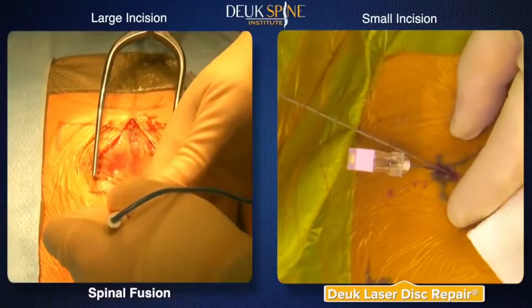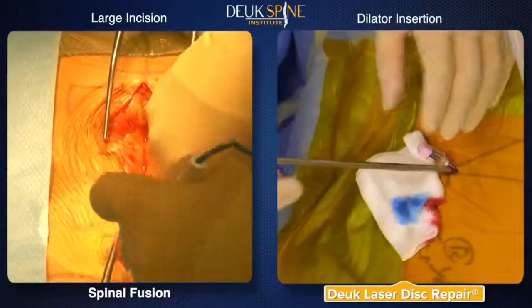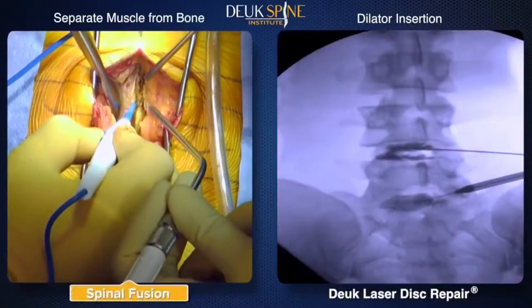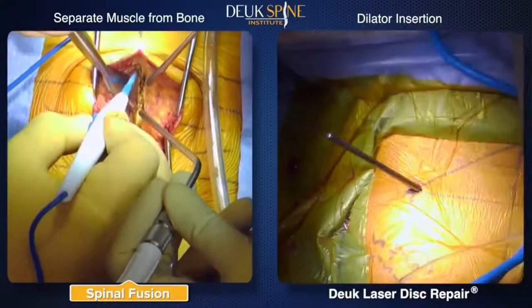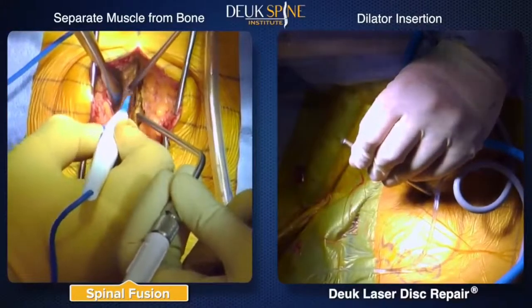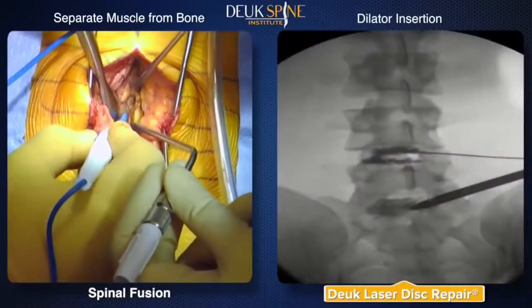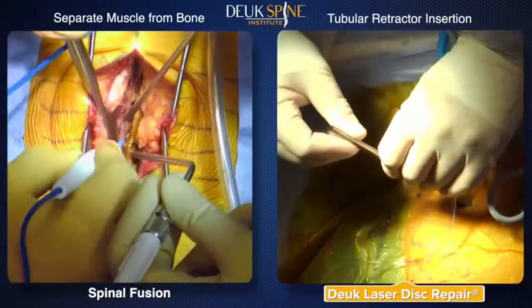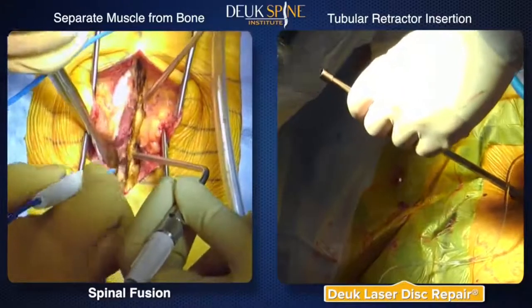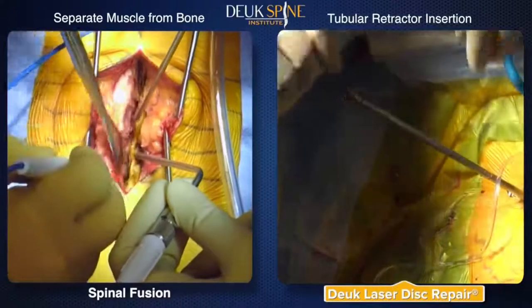In this small opening, a cylindrical rod, called a dilator, is inserted to gently spread the muscle to create a small passage and guide through which the surgery is performed endoscopically. The incision for the fusion continues, including penetrating the skin, fat tissue, and multiple layers of muscle through to the bone. With the Deuk Laser Disc Repair, a mallet is used to advance the tip of the dilator into the symptomatic disc. A tube, called the tubular retractor, slides over the dilator and is carefully positioned into the disc, again using the mallet. The rest of the entire Deuk Laser Disc Repair surgery will occur inside this narrow tube.